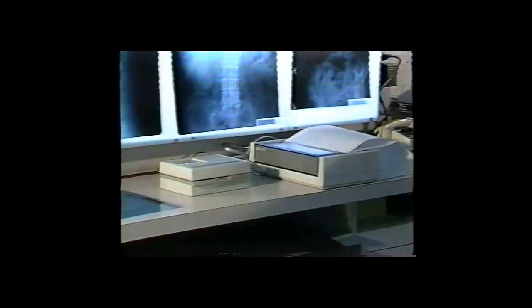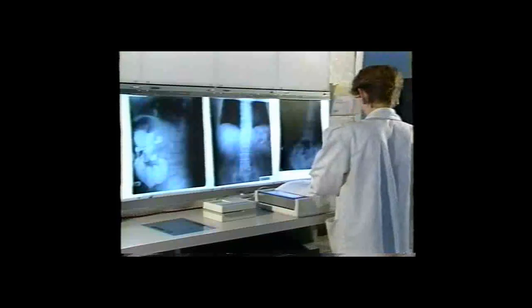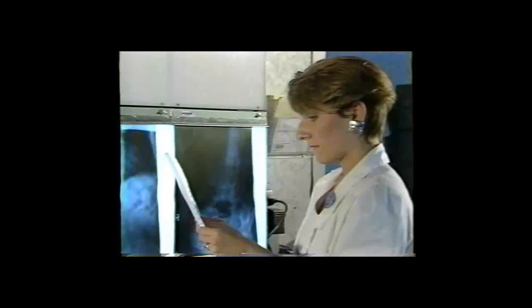X-Rite has built a powerful microcomputer into the 381 that prepares the processor control chart for you. That could save you up to 10 hours of technician time per processor per month.